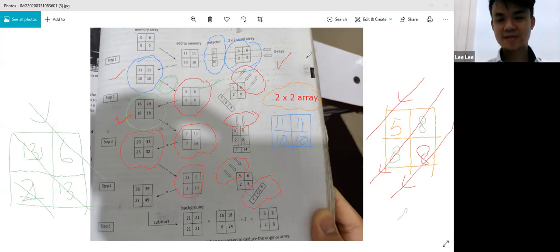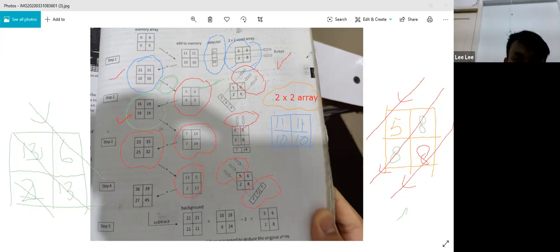So actually in our body, the reading is of course very complicated. The voxels are a lot, not 2 times 2, like million times million, right? So the process will continue, and then you see this here. So I think the process is clear. Now I'll explain what the background is.